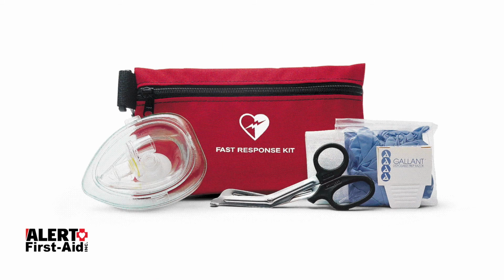An AED typically comes with a fast response kit. This kit includes a CPR pocket mask and gloves, scissors to cut clothes, a razor to shave a particularly hairy chest, a cloth to dry sweaty skin, alcohol wipes, and sometimes extra AED pads or pediatric pads.